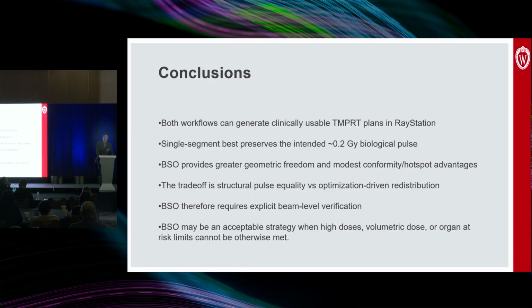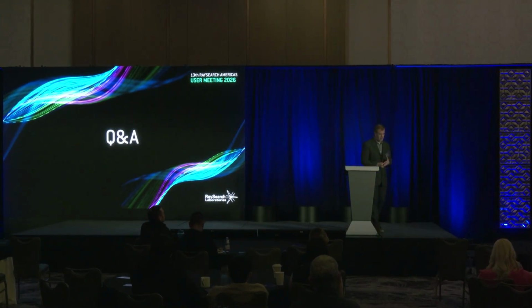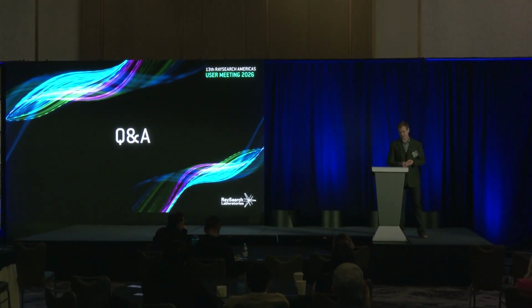Yeah, we have done a lot of validation of this in RayStation already. We've got a paper out about it, looking at the pulse-by-pulse analysis, and a lot of work in GAFchromic verification that low-dose GAFchromic still works, and then some Delta4 analysis as a standard diode array.